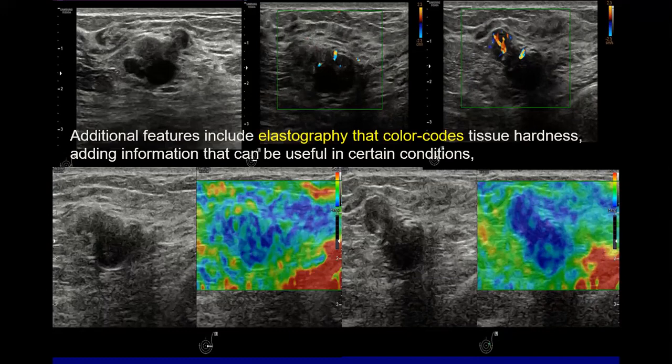Excellent. All right. So even what is apparently cystic here is hard. It appears hard on elastography. So this is mostly a non-cystic area, probably a necrotic part rather than just a cystic part. See, this is apparently cystic there. It is also hard and it is large. So elastography upgraded this lesion. And this is one of the breast mimickers.